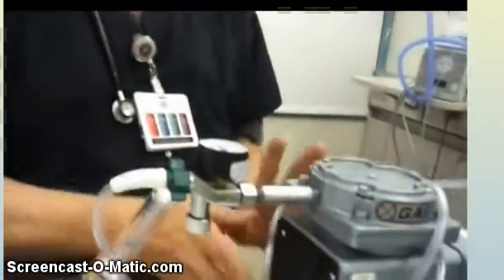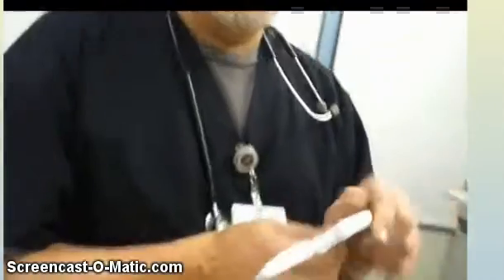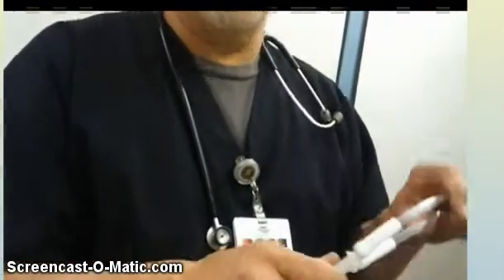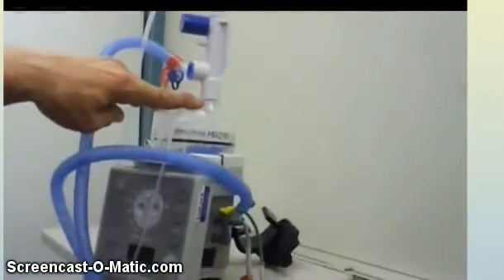Dr. Chapa and I have done is we've got this portable air compressor which will generate pressure from the outlet. What we've done is we split the gas and the pressure into two different lanes. This one, we're going to go to this flow meter. And as you can see, we're delivering high flow nasal cannula at 1 liter per minute to this patient here through the high flow nasal cannula system. This system will be shown as room air.